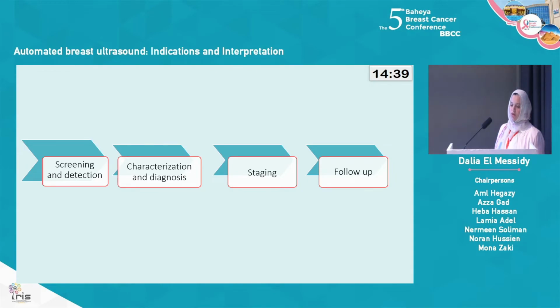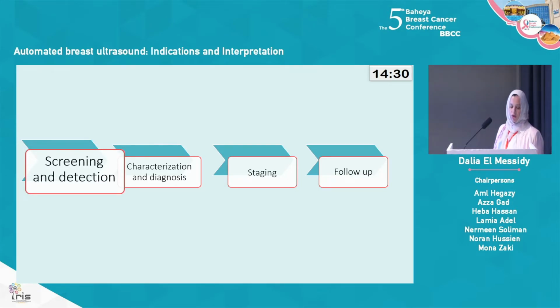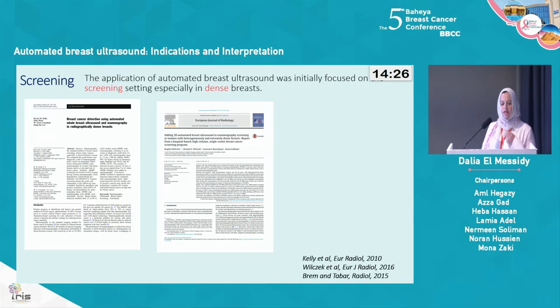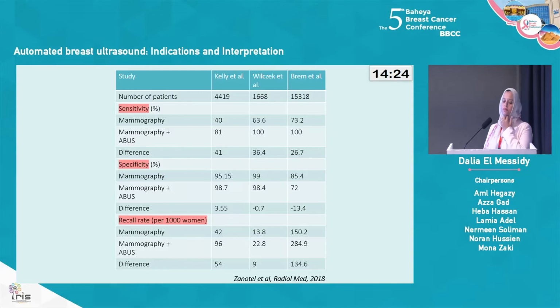Automated breast ultrasound can be applied through all stages of breast screening, from screening and detection to characterization to staging and follow-up. However, its application was initially focused on the screening setting, especially in dense breasts.